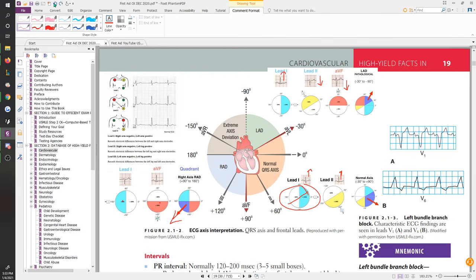So if I was to draw the normal AVF for you, I would draw it like, be the circle, and then it would be something like that. That would be your normal AVF. Right? So that if I overlap this blue circle and this normal AVF on top of each other, it would highlight this area into purple, right? And that would be the normal QRS. Okay, so I couldn't find an image where they had the normal AVF put into it, but here they're showing you the pathology of what happens in a right axis deviation, and then you can see how it's pointing towards the far right.